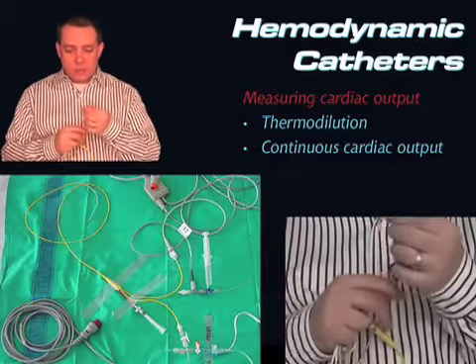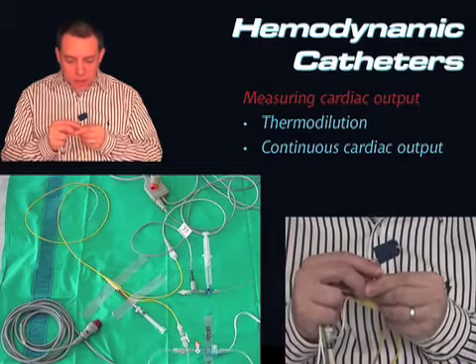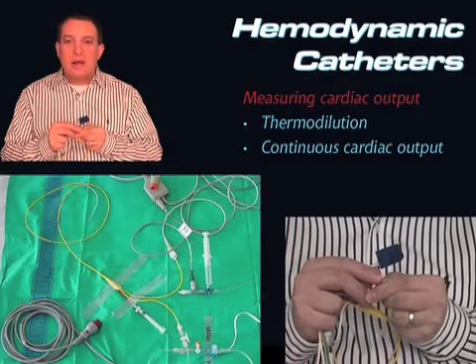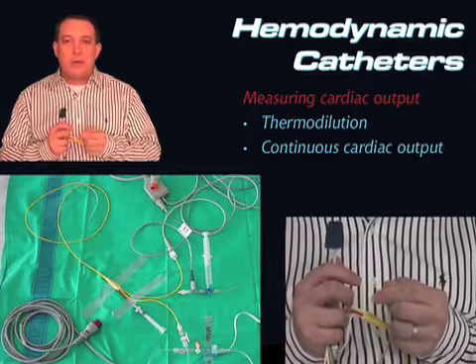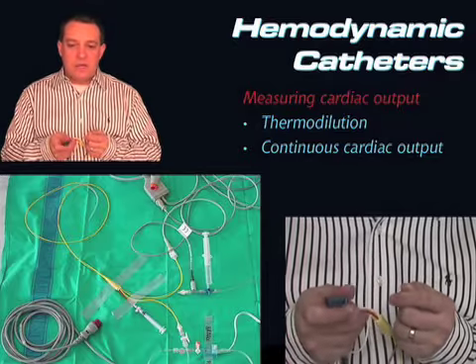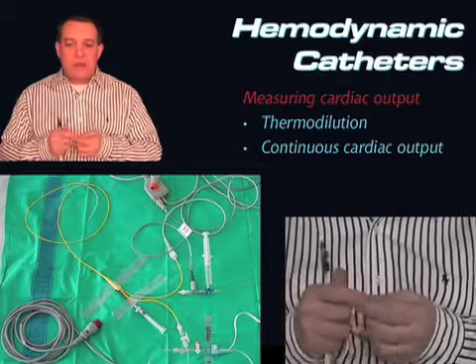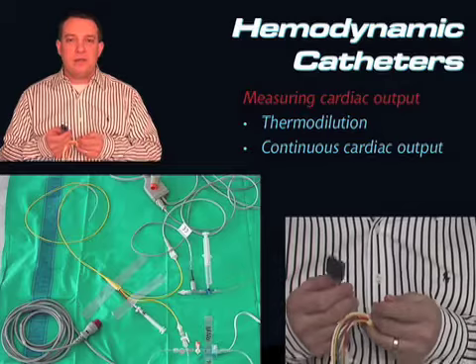it's going to be hard to see because it's so small, but right next to the hole where the distal port is, you also see this other little black line. That black line is actually the end of the fiber optic cable. And this fiber optic cable is actually just a pulse oximeter. So when we stick this into the vigilance monitor, what we have is a continuous waveform that allows us to bounce light off hemoglobin, and we can get a pulse ox off of this as well.